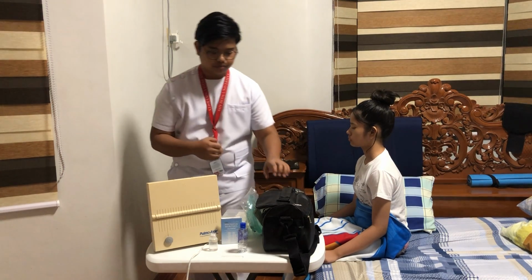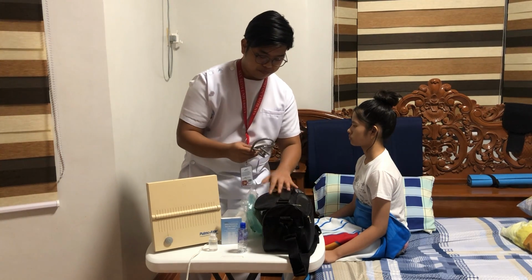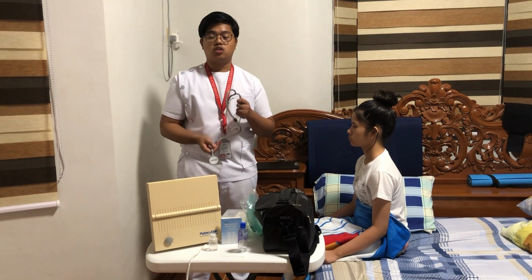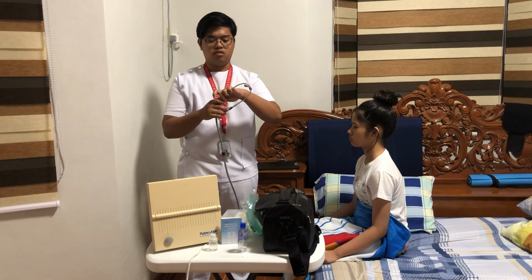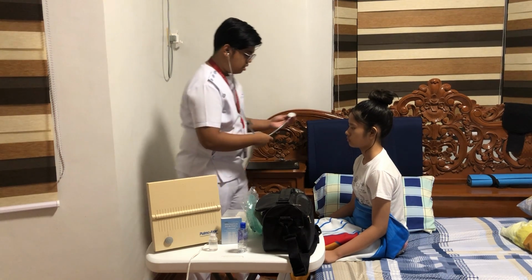Now that our patient is in the high Fowler's position, as I've mentioned earlier, we need to auscultate to hear her breathing sounds. So we have our stethoscope, and we're going to auscultate our patient to obtain her breathing sounds. In using the stethoscope, we need to warm the diaphragm so that the patient won't feel shock if we're going to apply it in the skin.